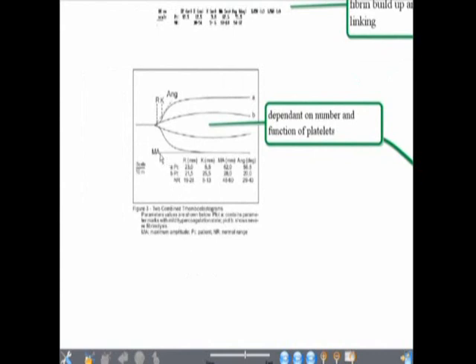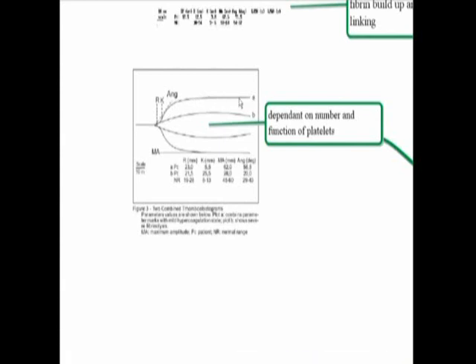It's rising and stable for a long period there, so it's a strong clot. This one is only rising a little bit, and it's not even stable. It's coming down, so it's not that good. So the number of this person's platelets is probably deranged, either deranged or not functioning properly. Because, like I was saying before, you can have a patient with few platelets who is not bleeding. Why? Because they're functioning properly. So the function of the platelets is also important.